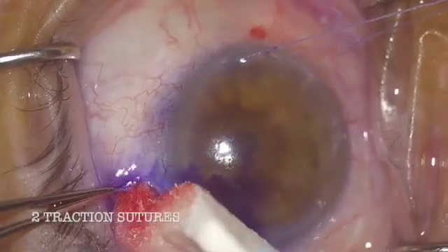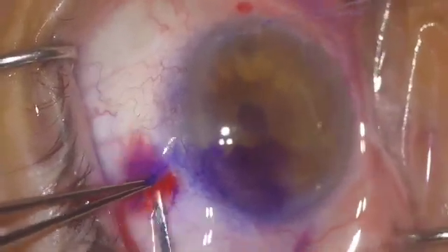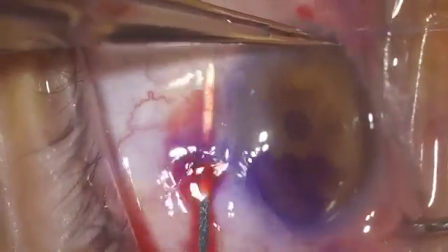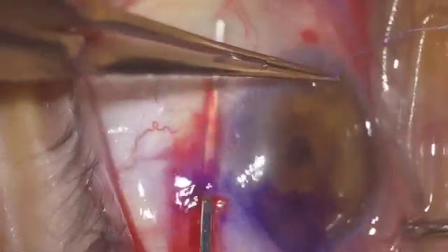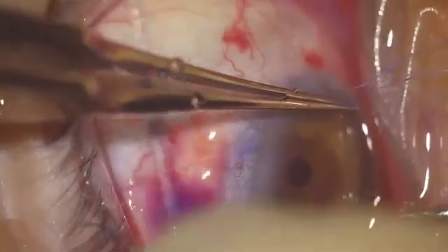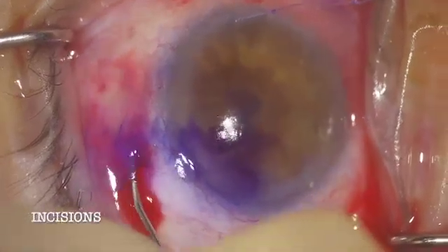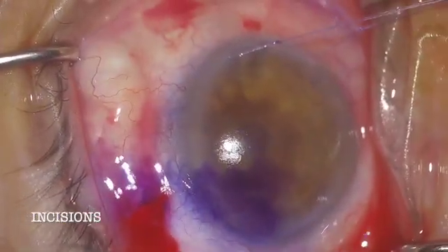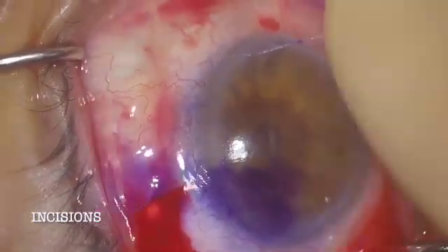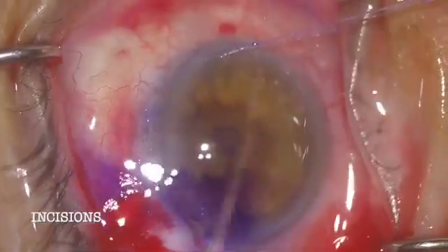These patients sometimes have higher risk for issues with many sutures. This patient has thin conjunctiva, he's had a liver transplant, and he's on mycophenolate (Cellcept) and tacrolimus. That combination should make him a pretty good bleb durability candidate, so let's jump into the steps for my approach.